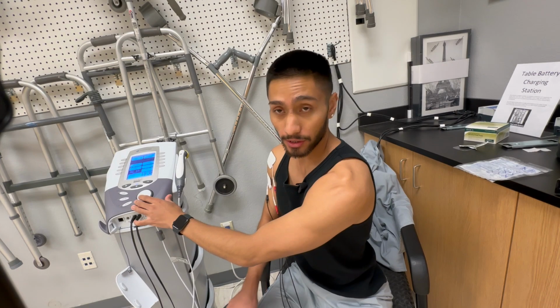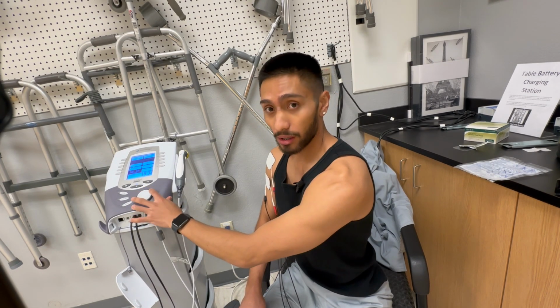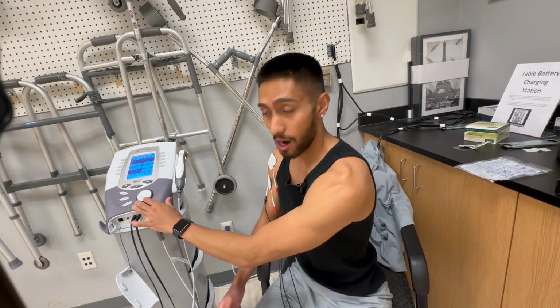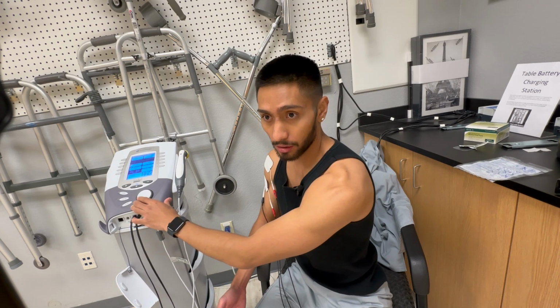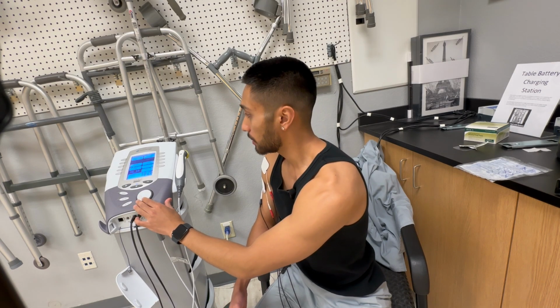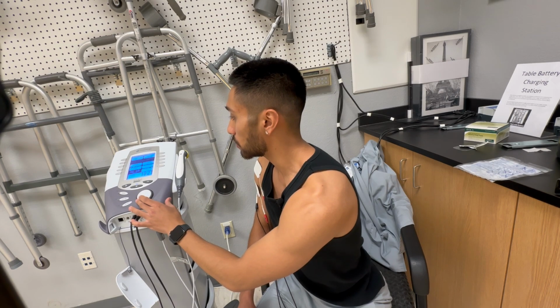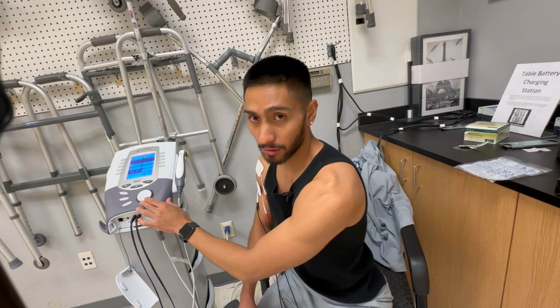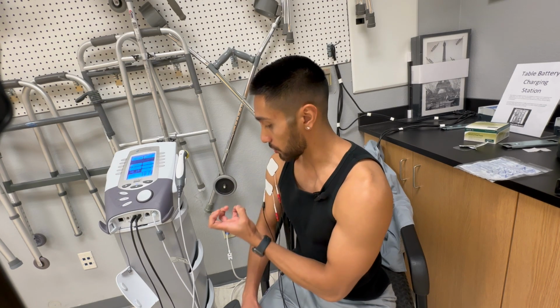And the intensity can vary between different patients. Some might be higher than ourselves as patients, some might be lower. It's all dependent on patient feeling. Right there, I just felt a muscle twitch, so I'm going to go ahead and turn it down because we're aiming for a tingling sensation, not a twitching going on.